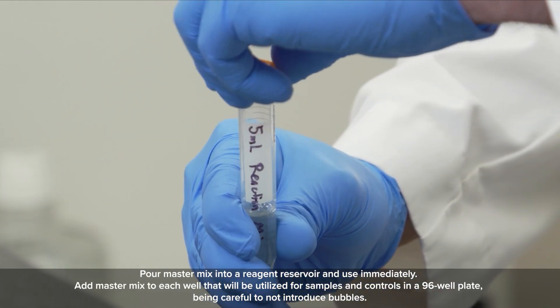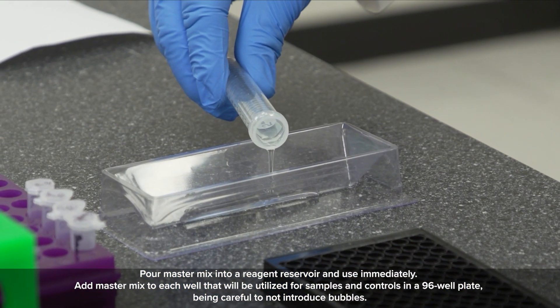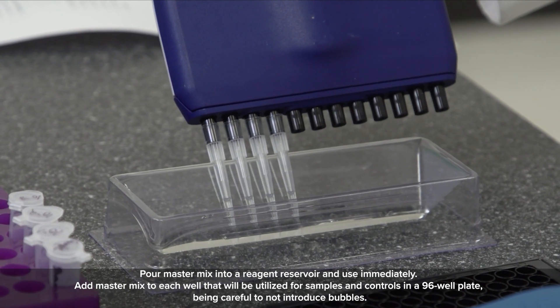Pour master mix into a reagent reservoir and use immediately. Add master mix to each well that will be utilized for samples and controls in a 96-well plate, being careful to not introduce bubbles.